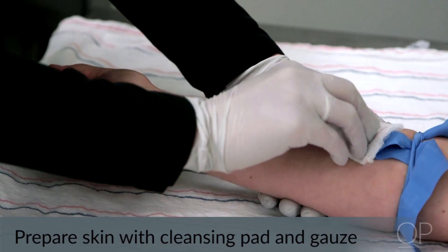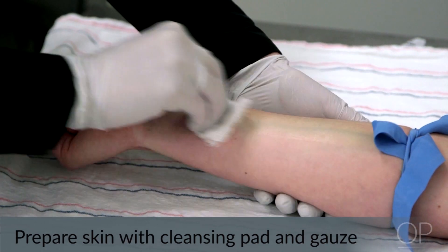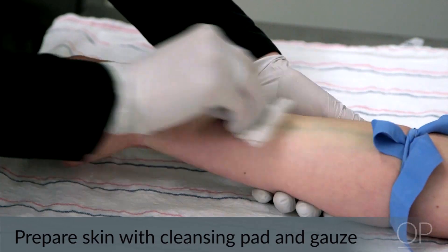Next, you will want to prep the skin using your cleansing prep pad and gauze. Let the area dry for approximately 30 seconds.